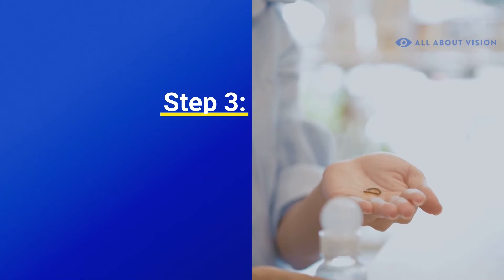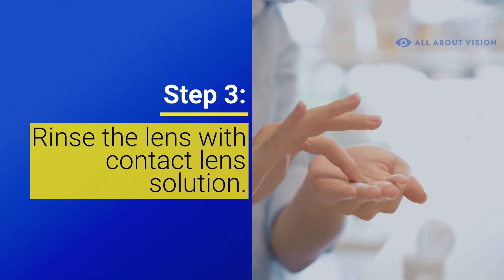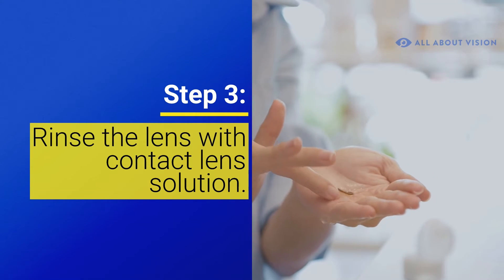Step 3. Rinse the lens with contact lens solution. This removes debris and helps it stick to your eye better. If you drop the lens at any time, rinse it with solution again before placing it on your eye.